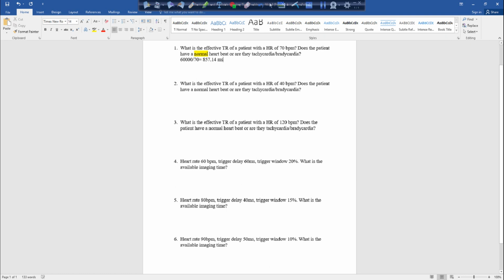And that 60,000, once again for the online students, comes from there being 60,000 milliseconds within a minute, because our minutes cancel out in beats per minute. To get to 60,000, it's 60 seconds within a minute times 1,000 milliseconds within a second.